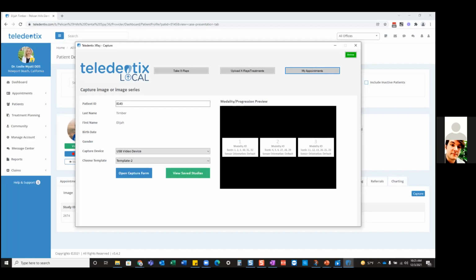All right. So here we have another great question that says, can we have a patient file without an email address associated to it? Or is it just for the offline feature, and then you would add it right after? Correct. When you're adding the appointment offline, there have been a lot of instances where patients don't know their email.